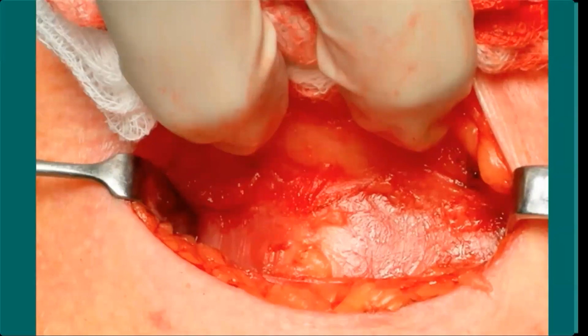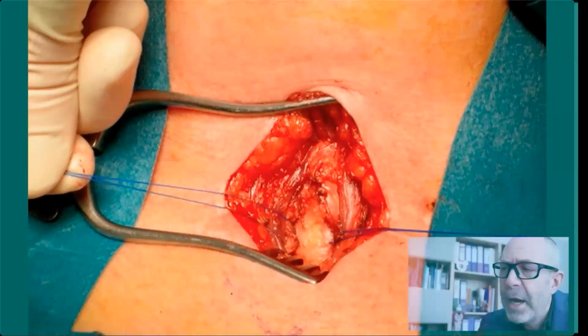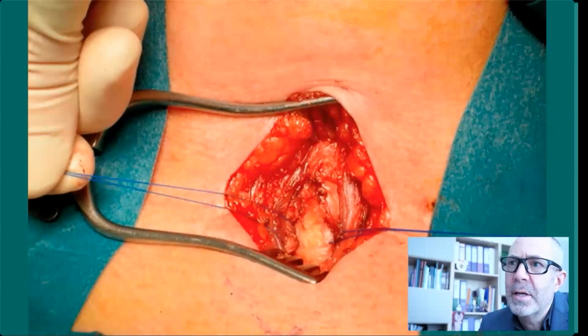Moving on through the surgical procedure: skin incision, blunt dissection, and then exposing the pretracheal fascia. Here we've divided the thyroid isthmus, usually using bipolar diathermy. Stay sutures are in place. These are all placed around the second or third tracheal rings, and then we cut a window into the trachea itself between the stay sutures. And the purpose of the stay sutures, as I said before, is to elevate the trachea anteriorly and to open the stoma, which can help to secure the stoma and help if we need to change or replace the tube, particularly early on in the patient's course before the stoma becomes established and mature.